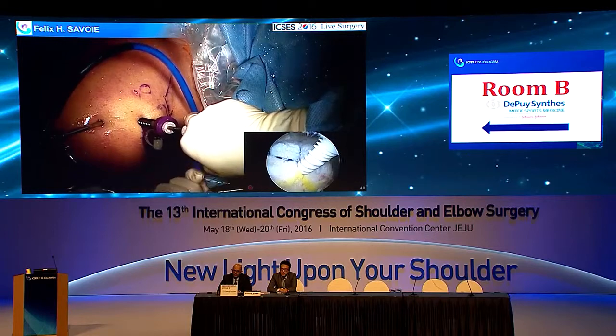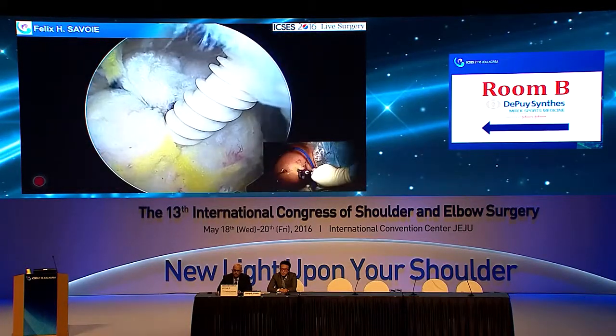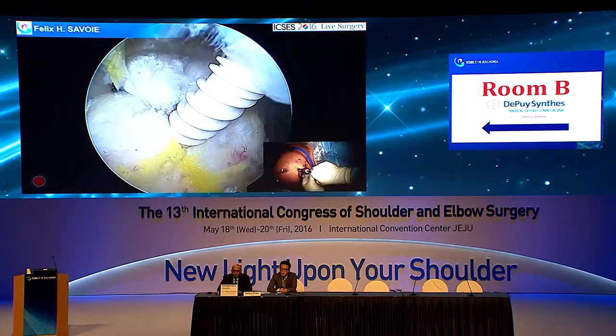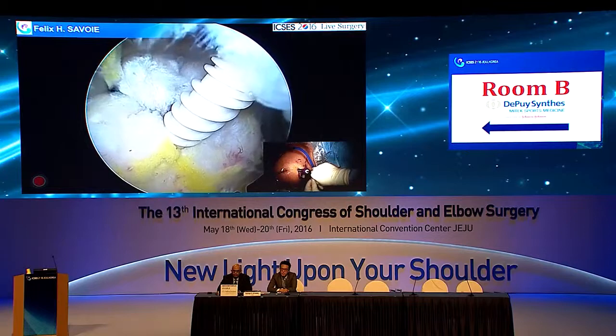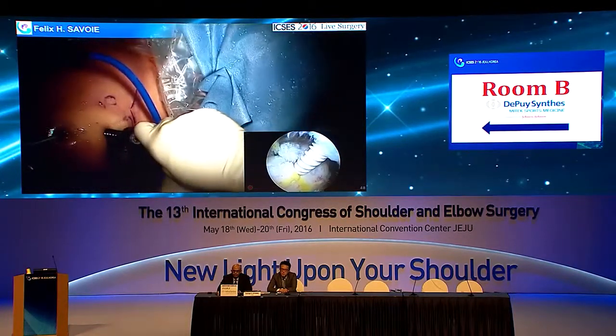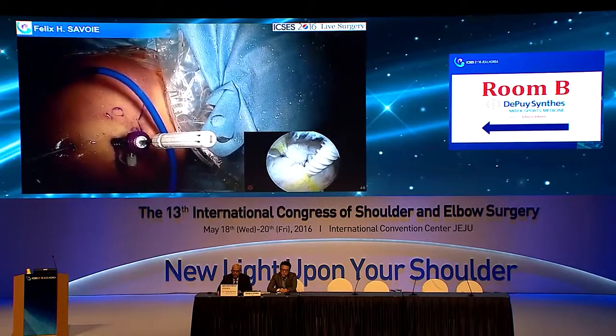See how that's pulling down? We'll go back onto the inside view, please. Looks great. Now, if you go outside, you can see that all these are in the cleat. So now you see I have them all in this little white cleat that you were talking about. Can we zoom? Here we go. Hands away.